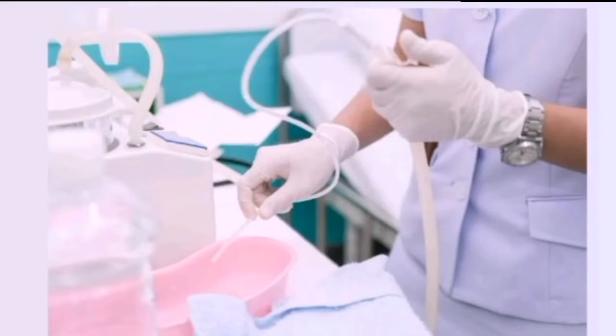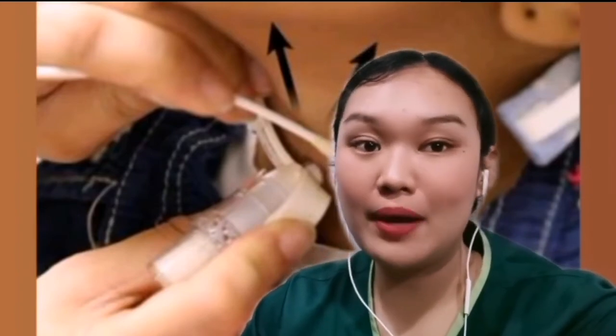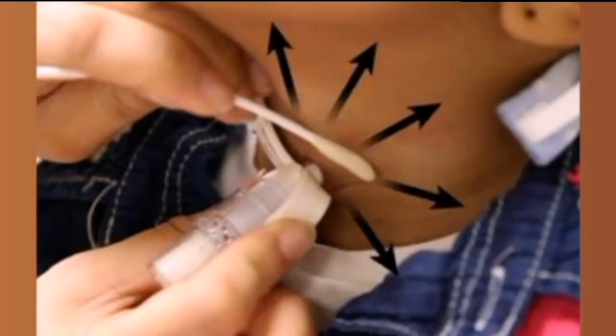For applying a clean dressing and holder. Remove the oxygen source if necessary. Dip a cotton tip applicator or gauze sponge in a cup or basin with sterile saline and clean the stoma under the faceplate. Use each applicator or sponge only once, moving from the stoma site outward. Clean gently with dry 4x4 gauze. Slide a commercially prepared tracheostomy dressing or pre-folded, non-cotton filled 4x4-inch dressing under the faceplate.